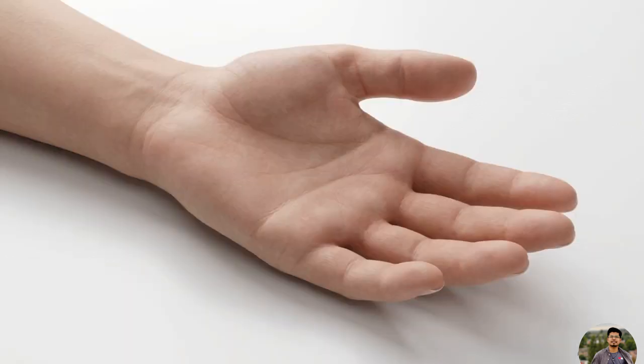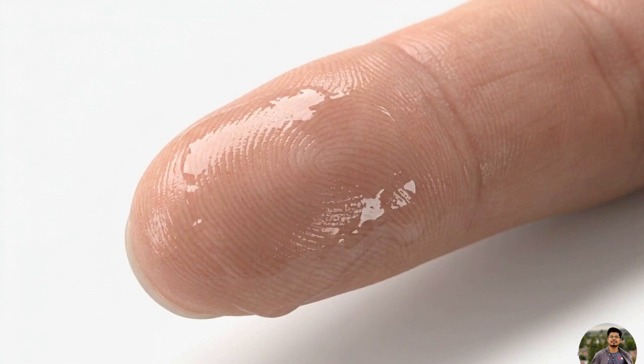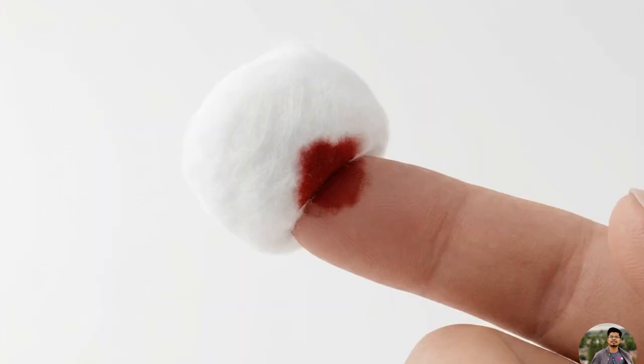Now it's time to collect the sample. Take an alcohol swab and thoroughly surface sterilize the tip of the ring finger on your non-dominant hand. Wait a few moments to allow the alcohol to completely air dry. Using a brand new, sterile lancet, give the fingertip a brisk, gentle prick. As the blood starts to pool, take a sterile cotton ball and wipe away the very first drop that oozes out to ensure a clean sample.